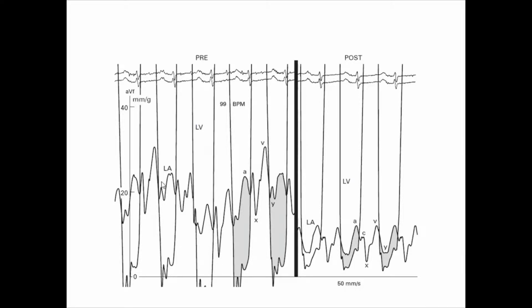So if we took, for example, a certain beat, usually to differentiate A from V, I have to look at the ascending and descending limbs. So yeah, this is the ascending, this is the A, this is the V. Here, the ascending, the A and V. Here, ascending, A and V. For example, here, the V is not high. In some beats, it is high, but in such case, not always. The mean left atrial pressure is high. And there is the diastolic gradient, okay?